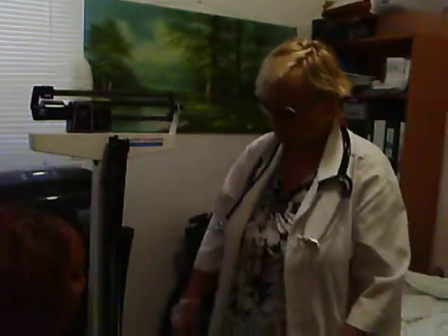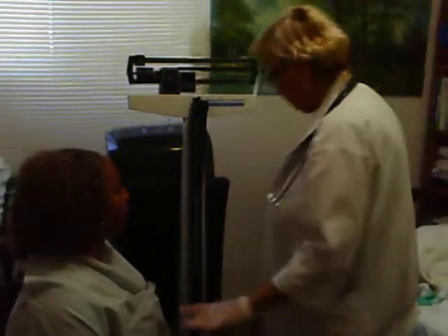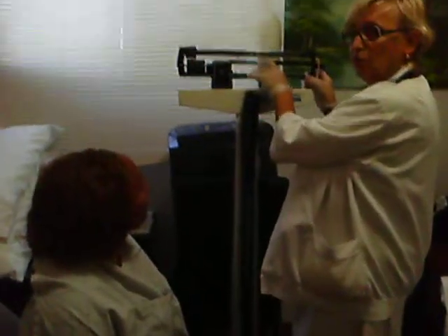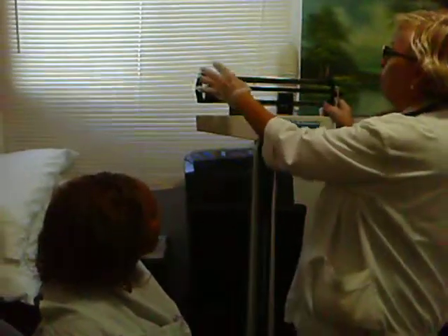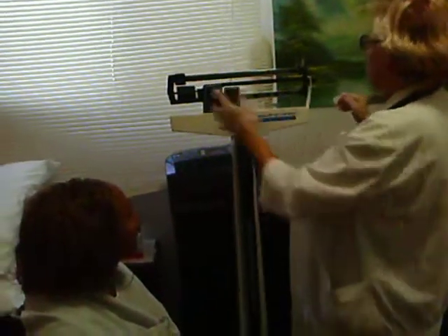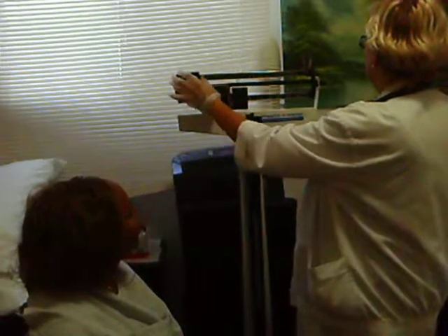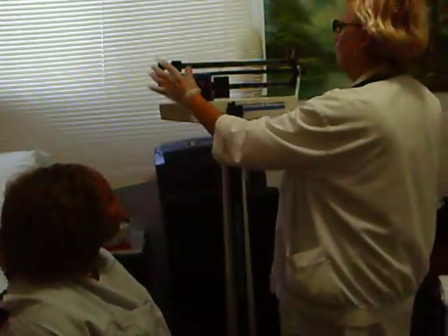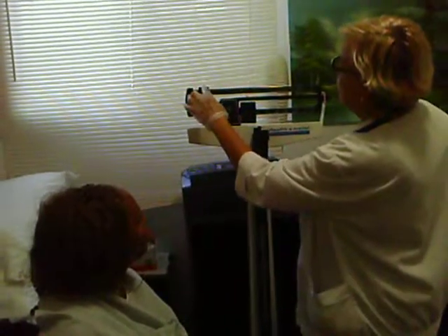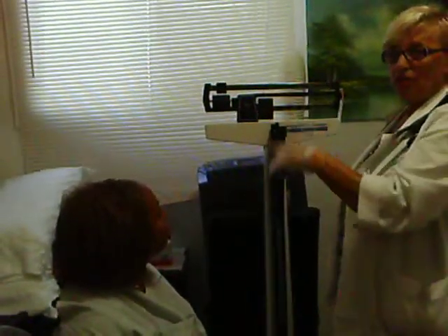Did you empty your bladder? Yes. Can you remove your shoes? Remove the shoes. Do you have anything heavy in your pocket? No. I am going to balance the scale — it should be at zero. If the scale is not balanced and it reads two pounds off, you should subtract two pounds from the total to be accurate.